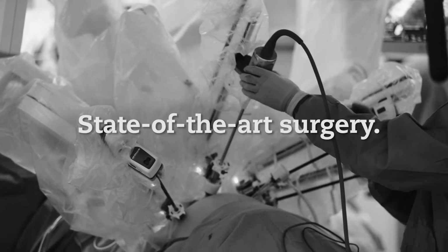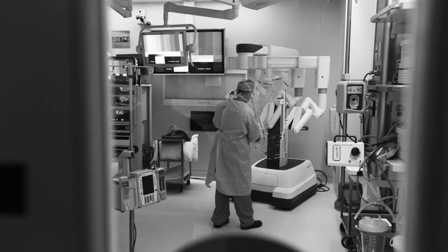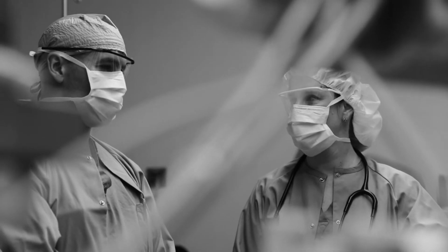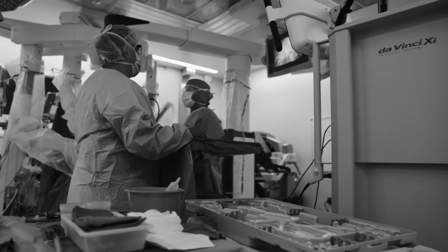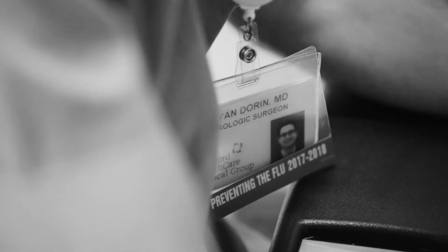At the Hospital of Central Connecticut, we have patients who need to have their bladders removed because of bladder cancer. And in order to provide them the most functionally normal recovery afterwards, one can create what's called a neobladder. And that's where I create a new bladder for the patient out of their small intestine. We have been performing these laparoscopically with the aid of the robot, giving patients a faster recovery and less chance of complications.